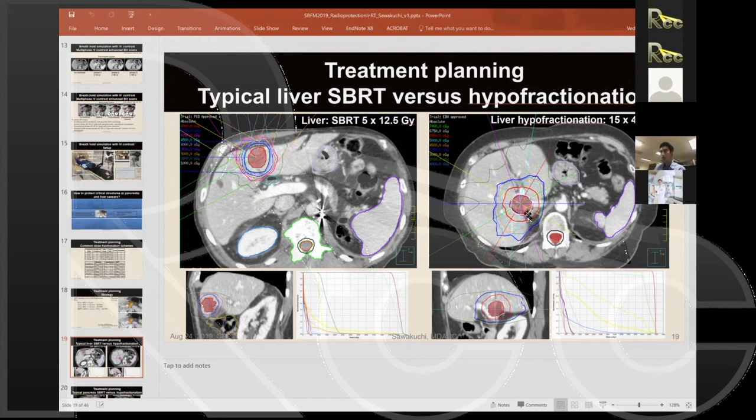So when you have the fiducials implanted, when you do your imaging, you base your alignment mostly on the fiducials, I assume? Yes. We use that as a guide and then make a best guess estimate of where the target is in relation to the fiducial, because one has to also be aware that the fiducials can shift during a treatment course.